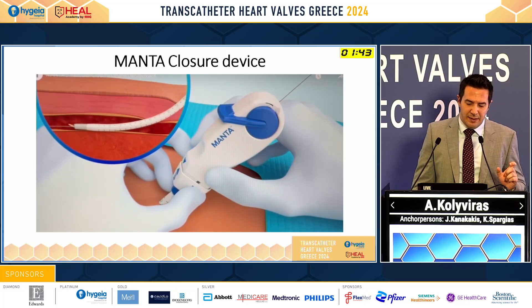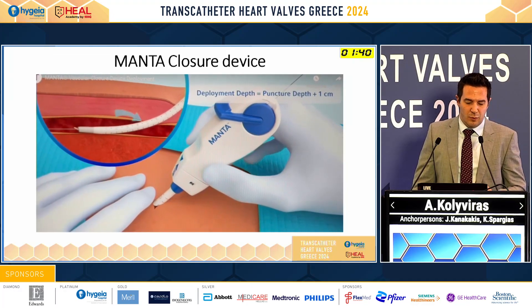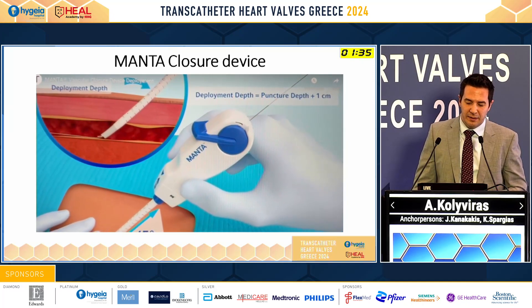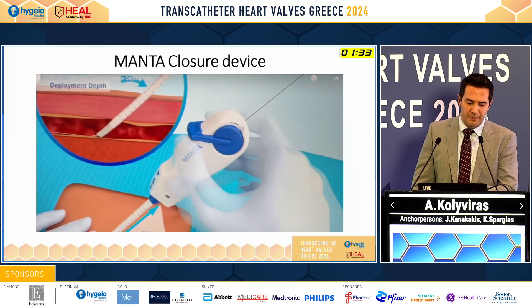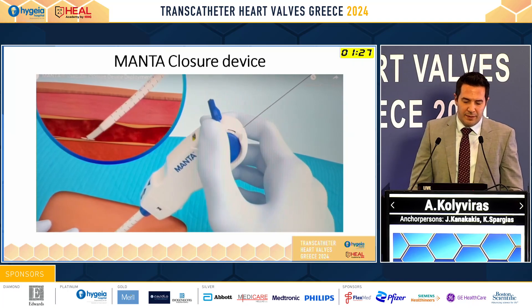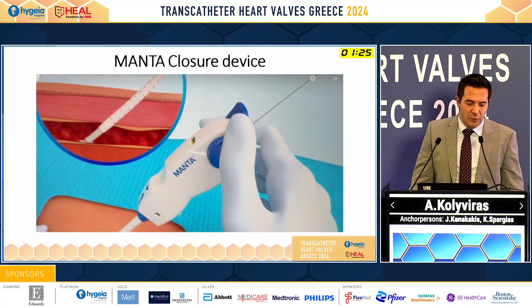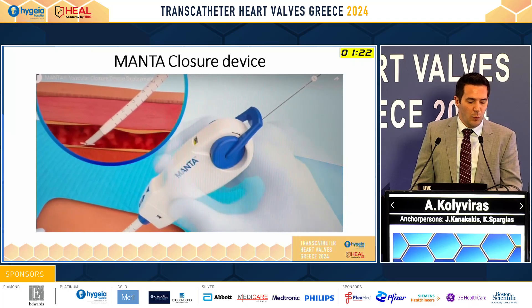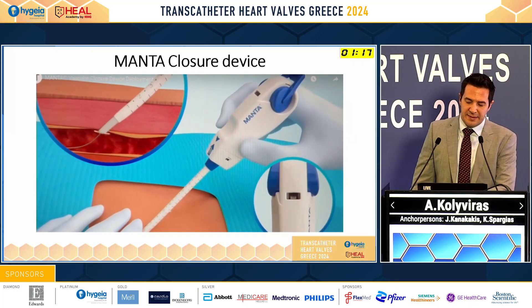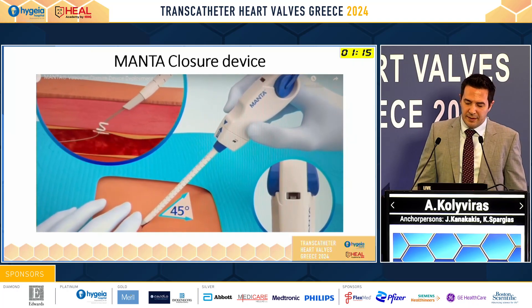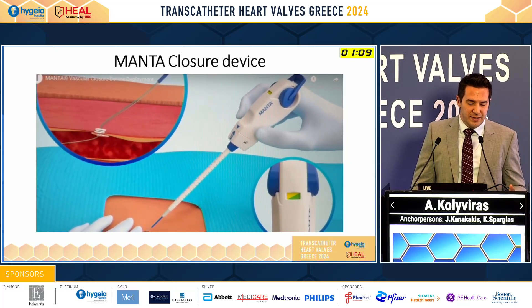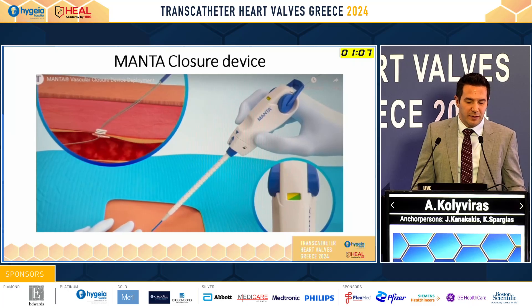We listen for the first click and pull back the whole device. We have calculated the deployment depth at the beginning, and we rotate the blue lever — in this way we release the anchor inside the vessel. We pull back. There is a green-and-yellow indicator, and pulling back the closure device, we release the collagen. In this way the arteriotomy is closed.